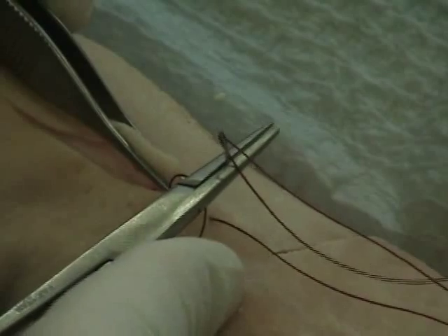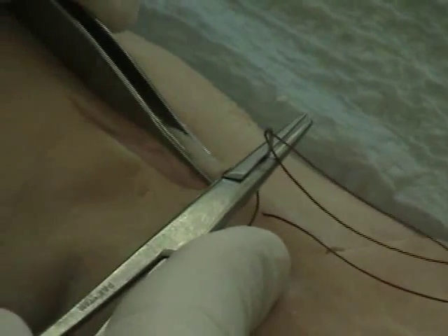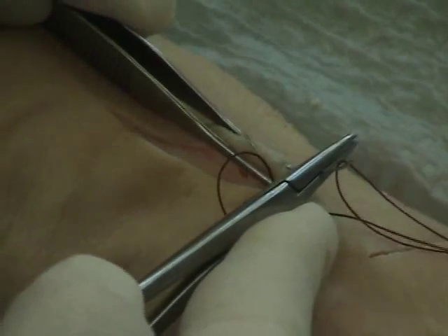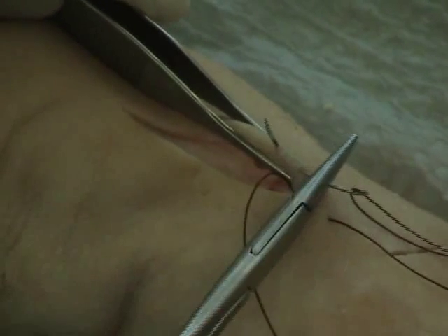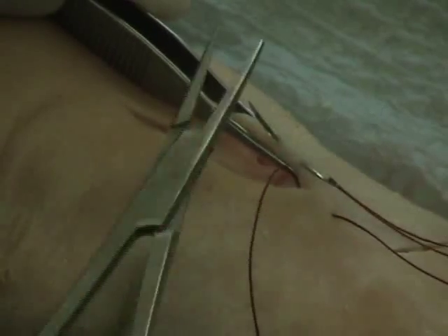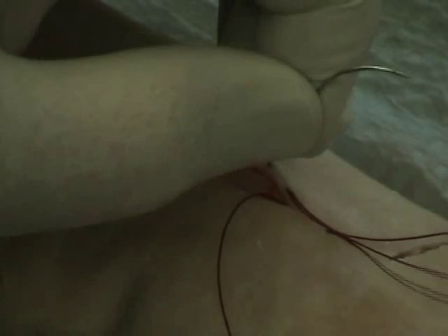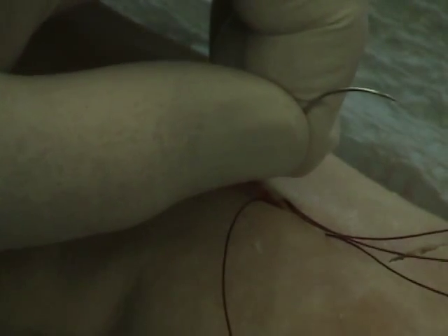My approach is to hold the stitch in a constant position and raise up one side or the other. By raising the side up, I turn it so the dermis is facing up, which allows me to stick the needle through. I control the depth of the needle as I pop it out. A bigger, deeper dig into the dermis gives a stitch that's further apart; the shallower I go, the closer together the stitches will be.